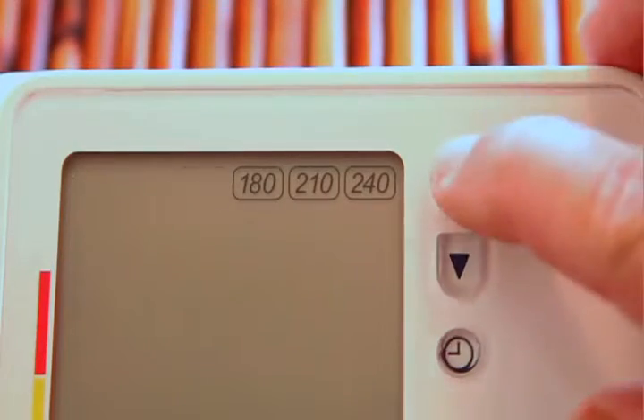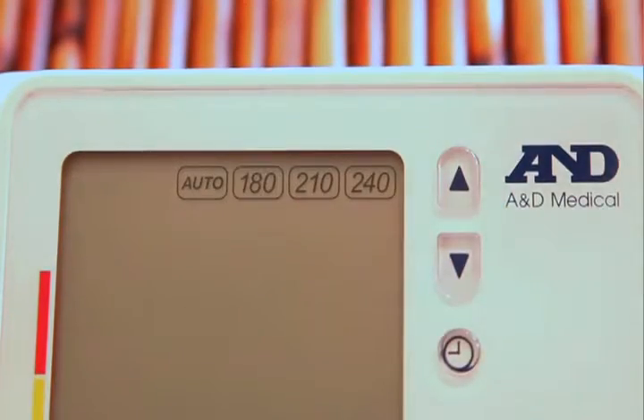After adjusting the time and date, the next screen you'll see is for setting the cuff pressure. You may leave it on automatic or select higher pressures for more rapid readings.